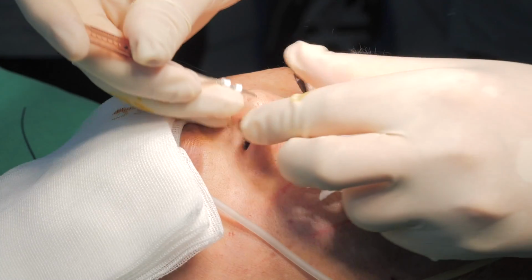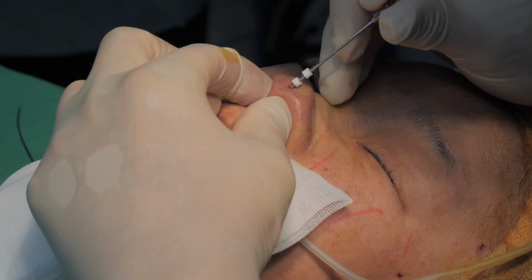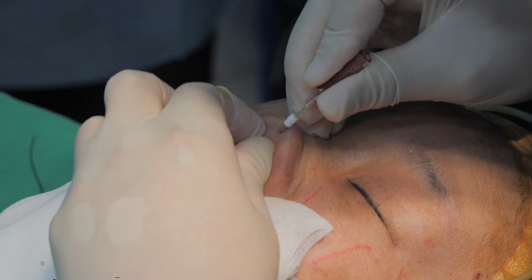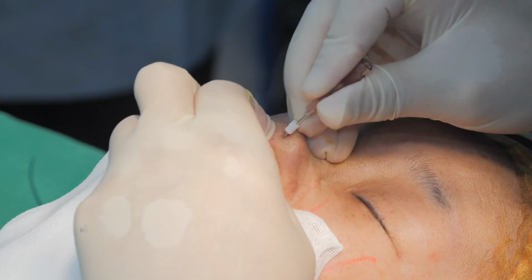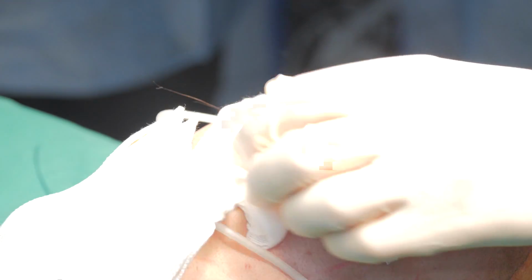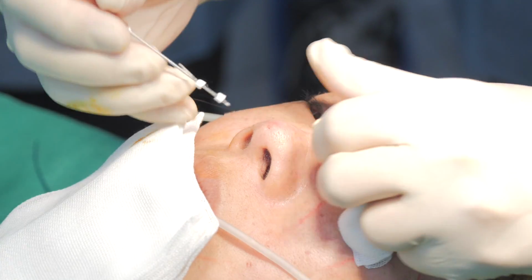Oh, it's very hard. Can you go straight down to the nasal bone? To the ANS, anterior nasal spine.